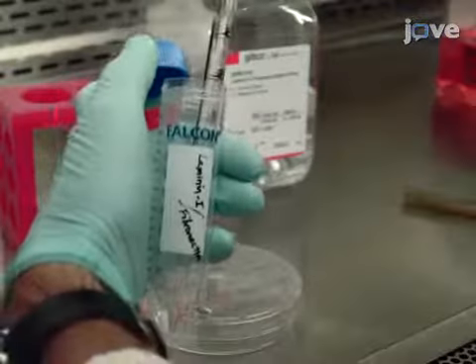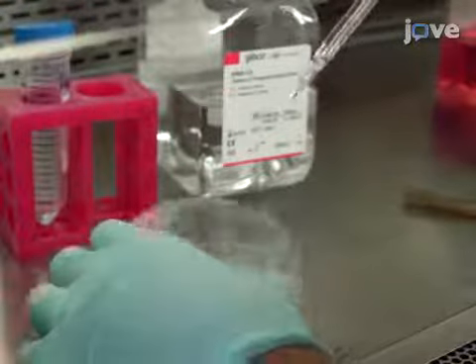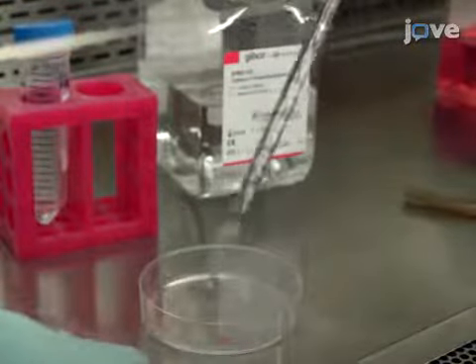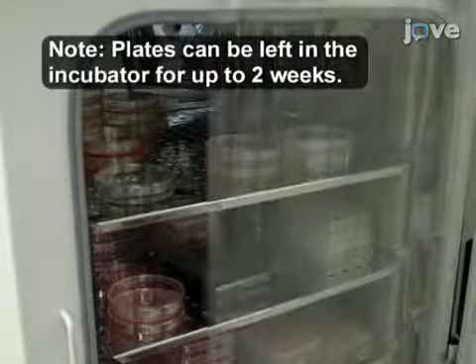Continue coating by adding 10 milliliters of PBS containing 1 microgram per milliliter mouse laminin 1 and 2 micrograms per milliliter fibronectin. Then, incubate the dishes as previously described.